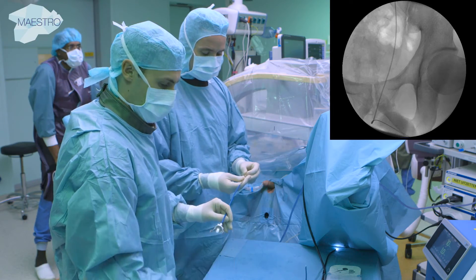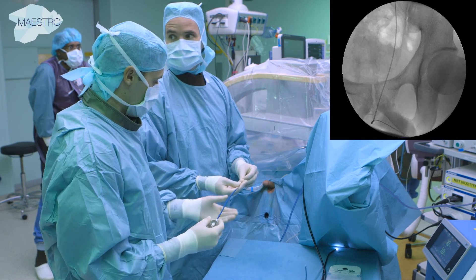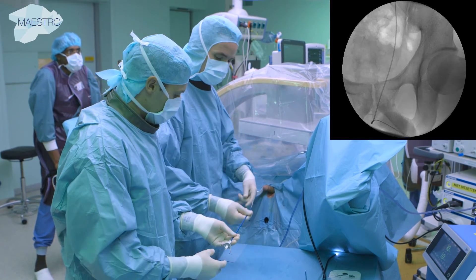Intrarenal pressure is kept at a low level, allowing for sufficient backflow alongside the endoscope through the access sheath.